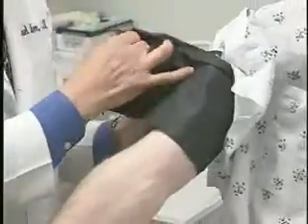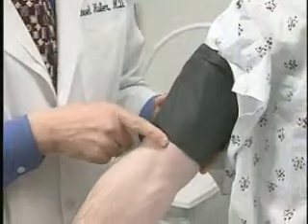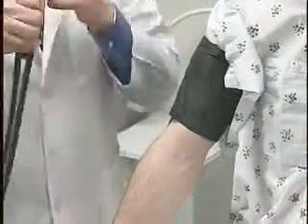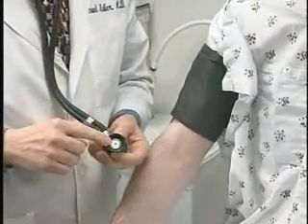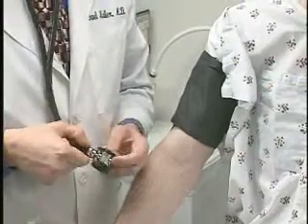Go ahead and place the blood pressure cuff snugly on his arm. You'll notice I'm approximately 2.5 centimeters above the antecubital fossa. Bates will recommend that you check the blood pressure with the bell of your stethoscope, but I think you'll find most physicians at Loyola use a diaphragm to measure blood pressure.